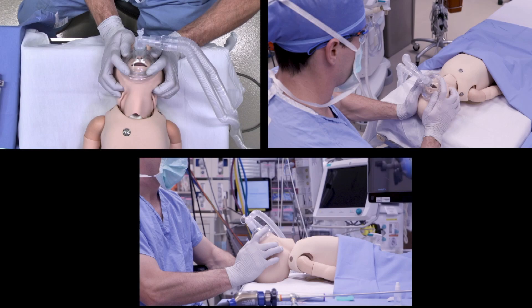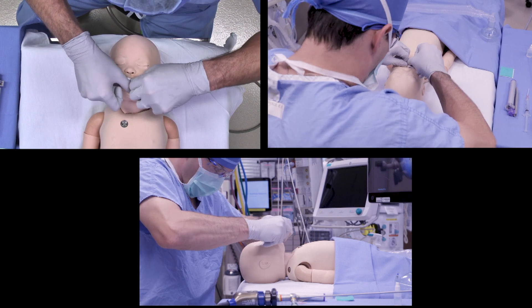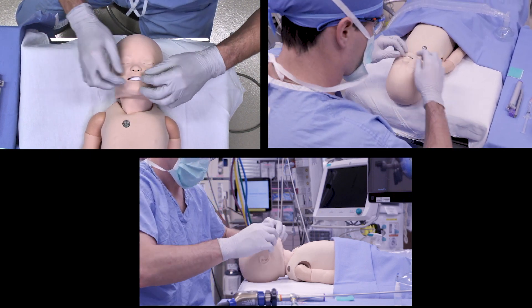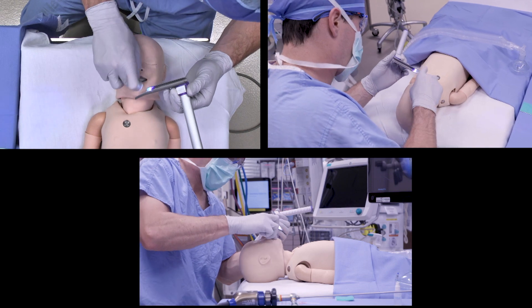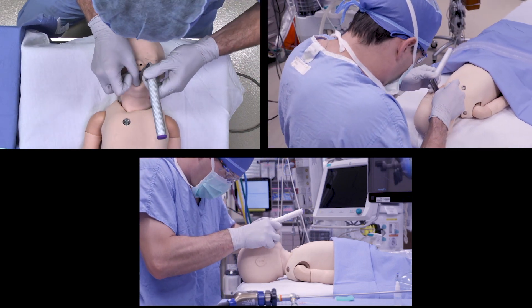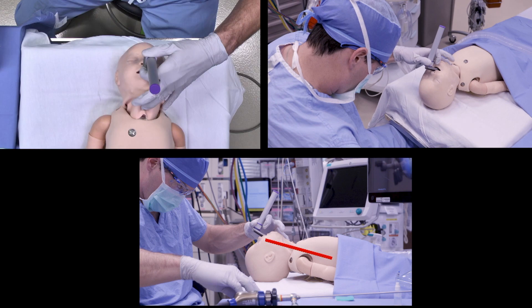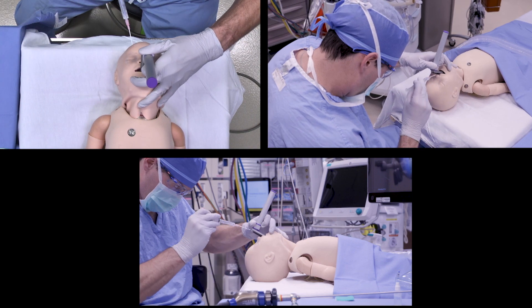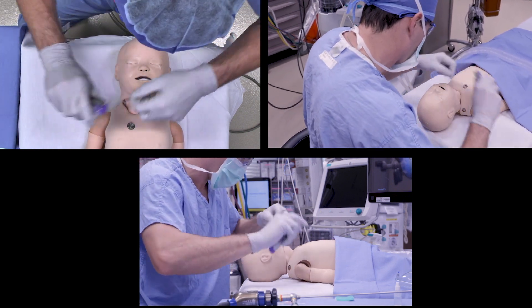Once the patient is under deep general anesthesia but still spontaneously breathing, the first step is to apply local anesthesia to the vocal cords. Place the mask down, apply the tooth guard, and open the laryngoscope. The laryngoscope is inserted in the right side of the mouth to completely slide the tongue to the left, then follow down into the vallecula to suspend the larynx. It's important to achieve excellent head extension — this allows the shoulders to rise and creates a straight shot from the mouth to the carina. In adolescents and adults this is more difficult, so sometimes a shoulder roll is needed. With the ring and pinky finger, manipulations of the larynx can be achieved to optimize the view of a difficult airway. Appropriately dosed lidocaine is then directly applied to the vocal cords, the airway is desuspended, the tooth guard removed, and masking restarted.